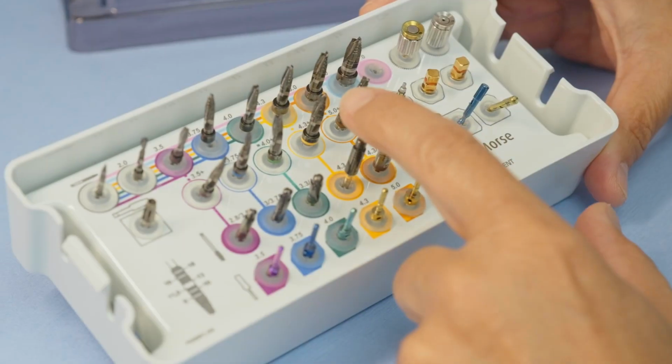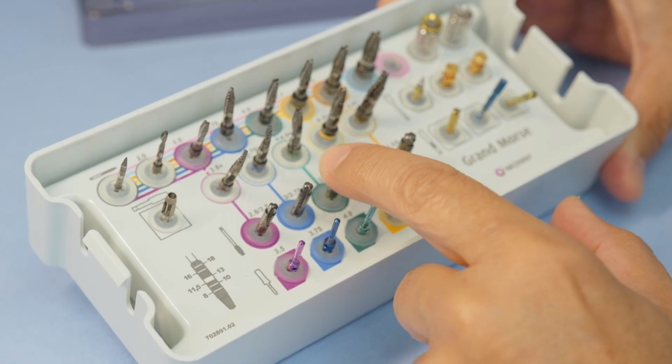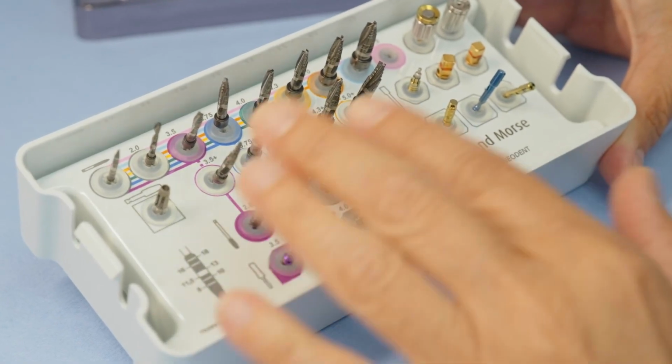When it comes down to sequential drilling, every single system out there is going to be color coded. In my office, I use a specific brand of implants. Maybe it's different than the one that you use in your practice, but I don't think that the color coding is going to be any different. They all today have that color coding, which makes it a lot easier for us to simply follow those color codes to the diameter and the depth of the implant that we are going to be using for a specific clinical case. So the most important thing that I want you to know is that first drill.